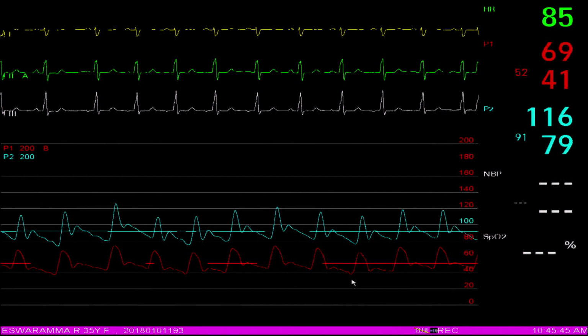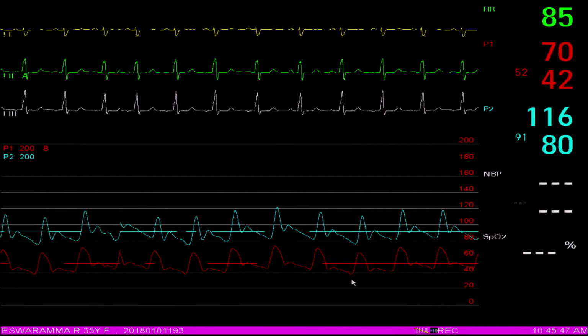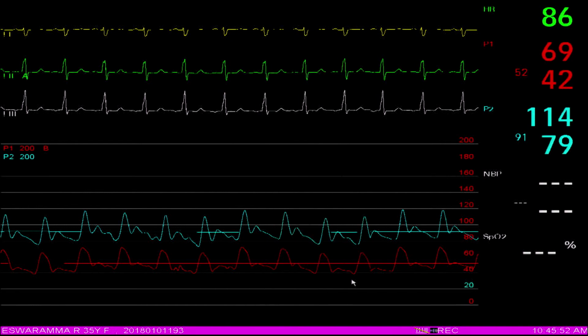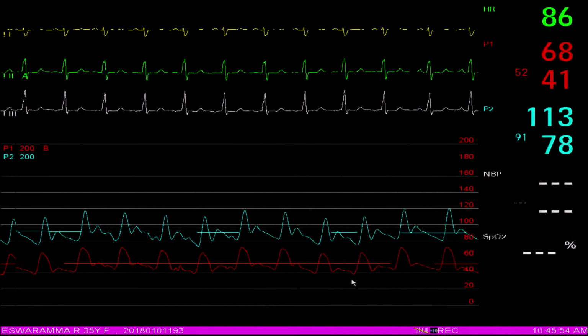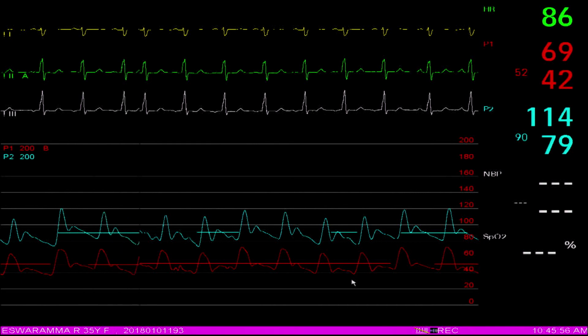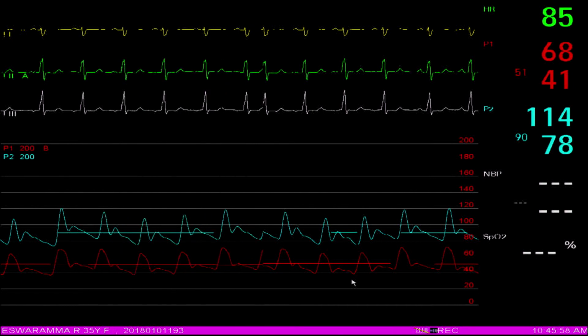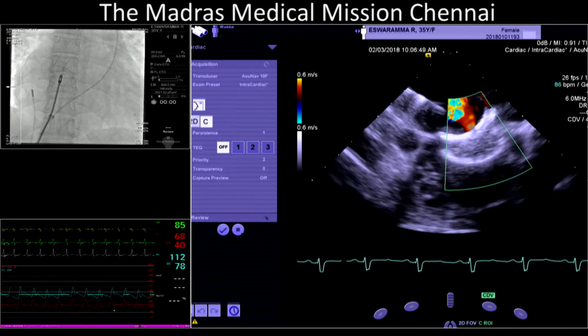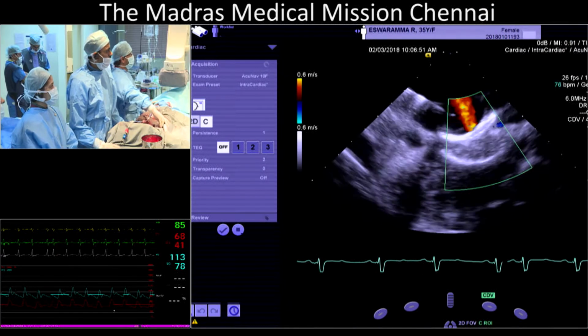So I'm going to release. What medication? Ismar has a question. Shiva, yes. Super good job. My question is, which drugs did you use for resuscitation of the patient? And the second question is, what is the gradient across the fenestration? You see a relatively high flow.